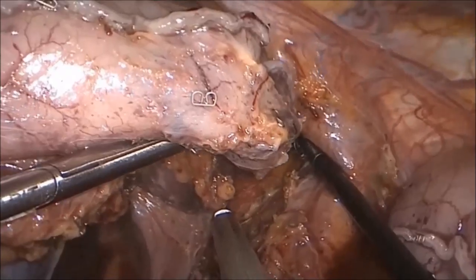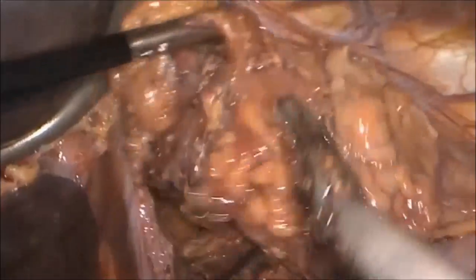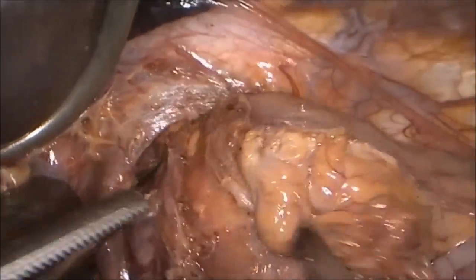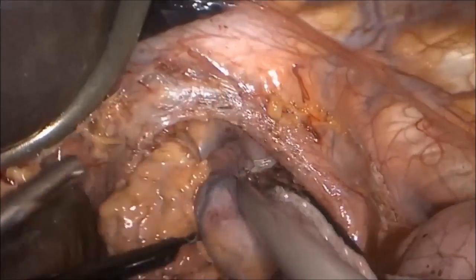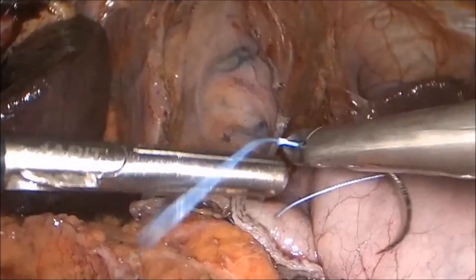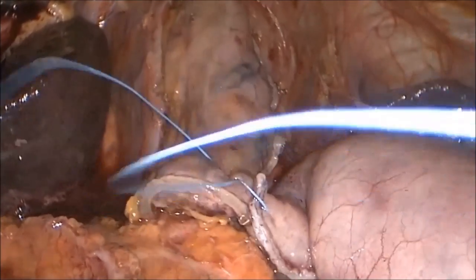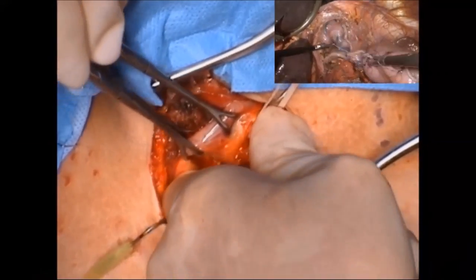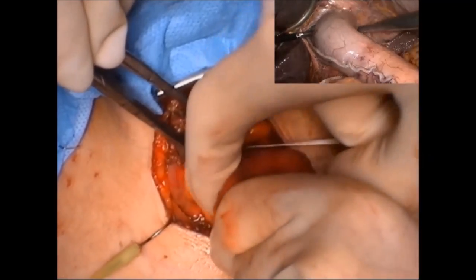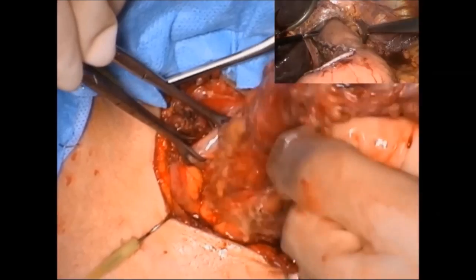The phrenoesophageal ligament must be incised in order to remove the specimen. The proximal end of the gastric conduit is then secured to the distal specimen so that the conduit can be pulled into position when the specimen is removed through the neck incision. Great care is taken to maintain the orientation of the gastric conduit as it passes through the chest in order to minimize the risk of compromised blood flow through the right gastroepiploic artery.